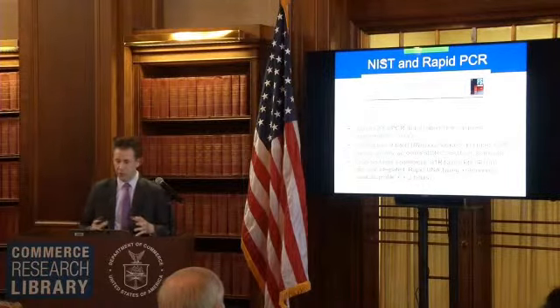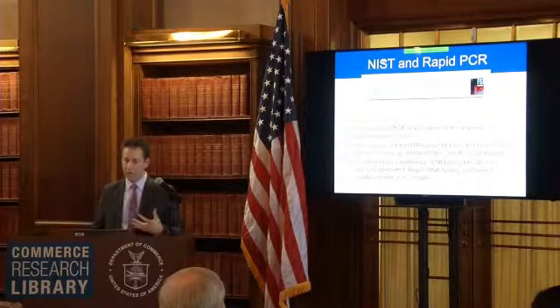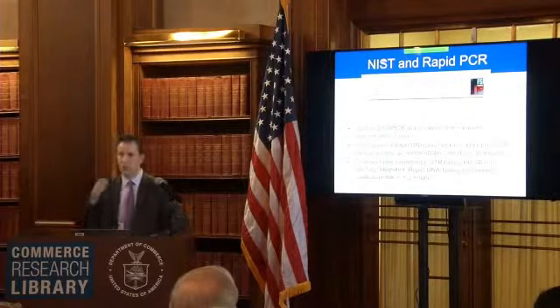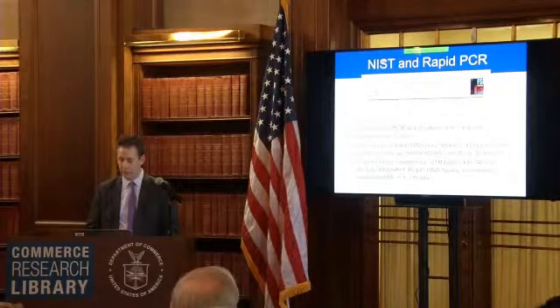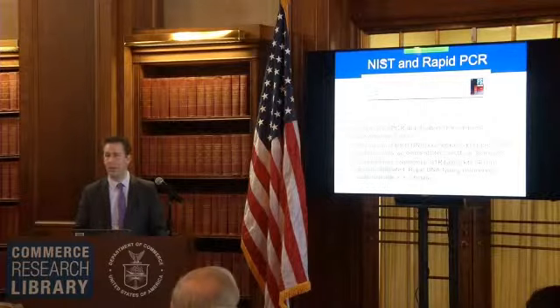And this is also supporting something we'll talk about in future technologies, the development of fully integrated rapid DNA instruments. We'll talk about those in a few minutes, but that's really putting a swab in a box or an instrument, hitting the go button, and then having a profile developed hands off in about 2 hours. So this is some of the technology that was worked up at NIST that's had an effect in the DNA typing community.